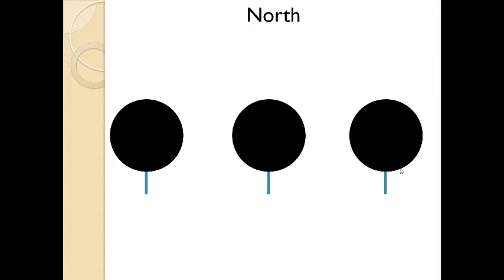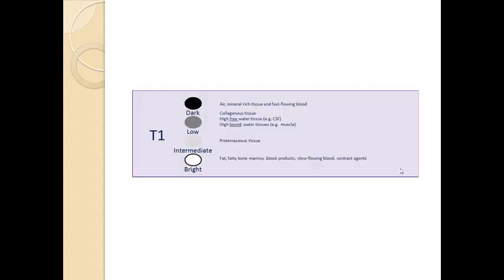And this is exactly what we're doing with the MRI. As we put somebody in the MRI, we magnetize the water molecules, then we energize them. We hit them with those radio frequency waves. We're talking about the non-ionizing radio frequency waves that energize them so that they're aligned in the opposite direction. And then we turn the energy off and we wait half a second, and then we take a picture. And we see where the water molecule is pointed, how much energy is left in it, and we construct a grayscale image from white to black, depending on how much energy is in there. And it turns out different kinds of tissues are going to produce different kinds of structures, different kinds of colors.